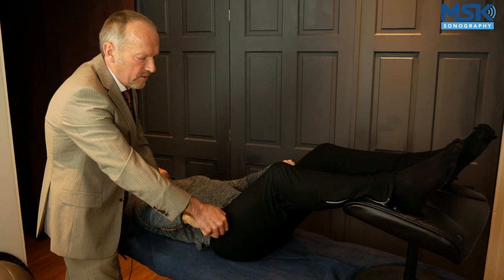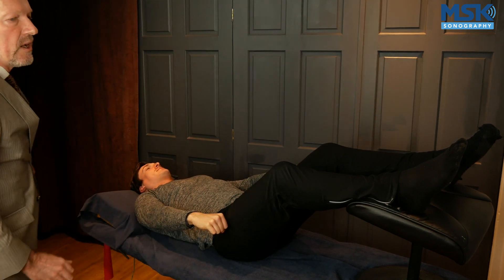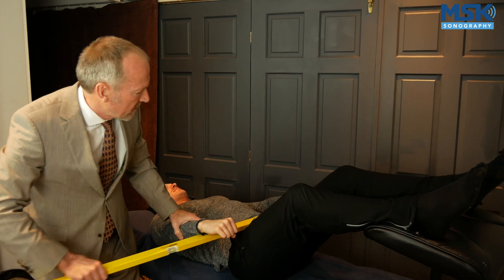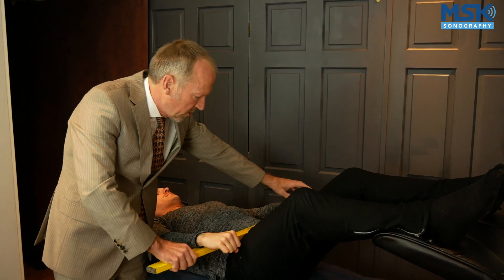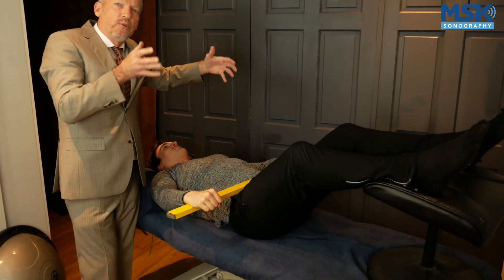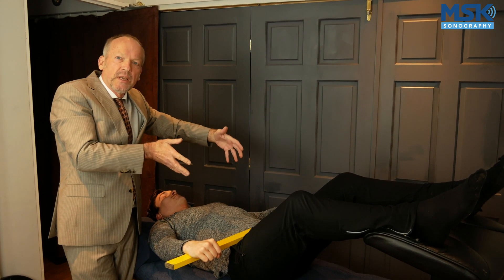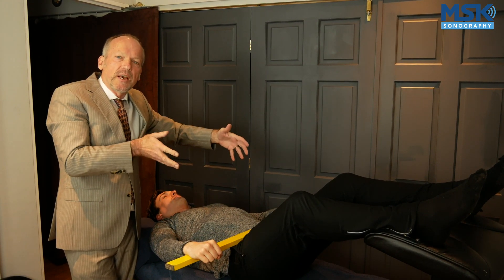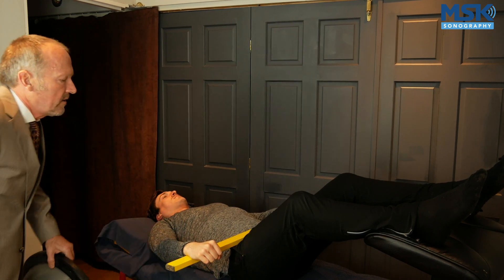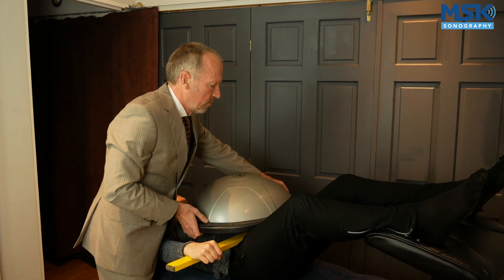Here you've got the phalanx — that's the level of the metatarsophalangeal joint. Deep to the metatarsal heads is the deep intermetatarsal ligament, shown by this. So already we're starting to layer our view from the dorsal aspect, where we've got a ligament above the nerve. What sits above the nerve and the ligament tissue is the bursa, represented by the BOSU ball.